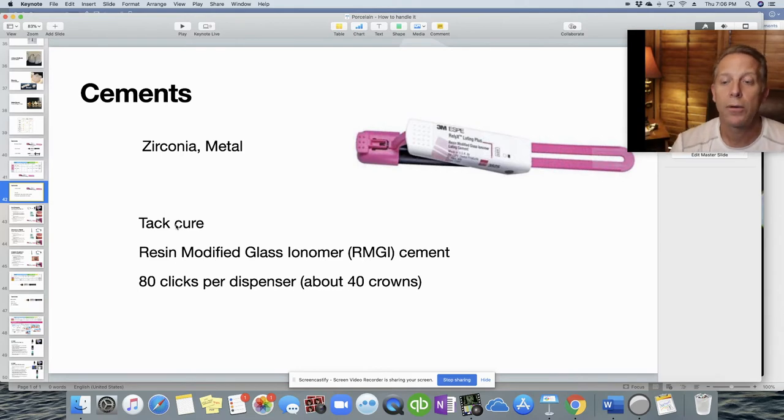A key feature of this cement is the tack cure. You place the crown and either wait two minutes for it to self-cure, or do a five-second tack cure from buccal, lingual, and occlusal surfaces. It takes two people: one holds the crown down while the other flosses out the interproximal cement. After about two minutes the cement is set. It's a resin modified glass ionomer — you get about 80 clicks per dispenser, two clicks per unit, so roughly 40 crowns per dispenser.